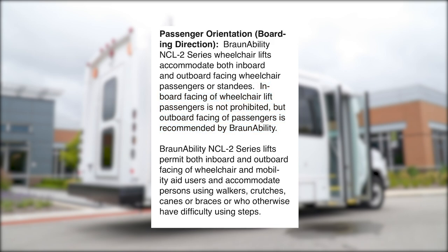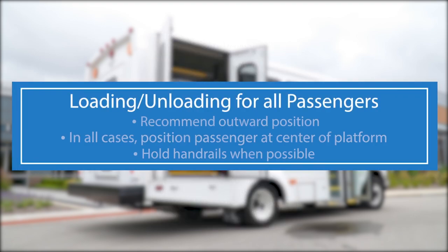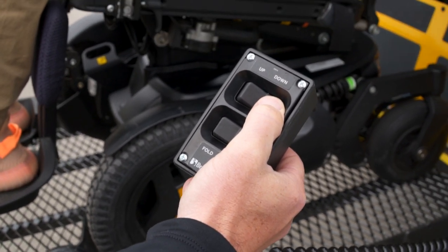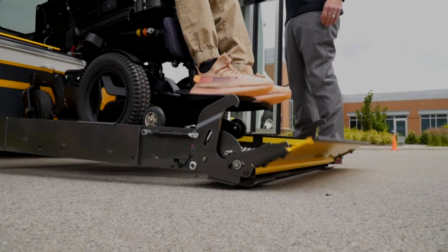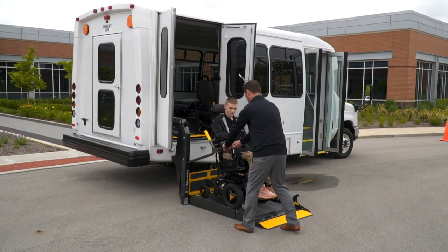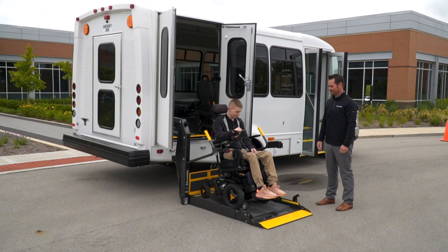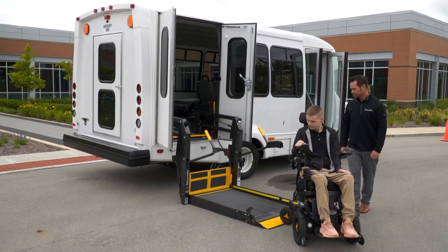BraunAbility can also accommodate passengers who use walkers or canes or cannot navigate steps into the vehicle. In all cases, however, it is critical that passengers, whether sitting or standing, are positioned at the center of the platform within the yellow boundaries to help ensure they have cleared the vehicle bridge and are in the proper position for side-to-side load balance and smooth movement of the platform. Once the passenger is in position, press and hold the down button on your handheld control until the entire platform reaches ground level and the outer barrier unfolds completely. When all movement is stopped and if equipped, unbuckle the handrail belt, unlock wheelchair brakes, or switch on wheelchair power if necessary, and unload the passenger from the platform.